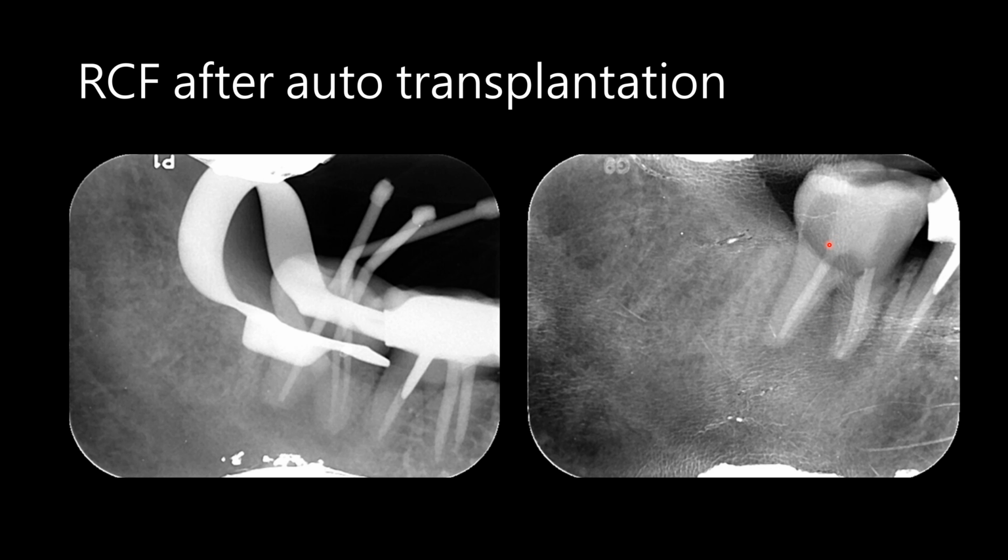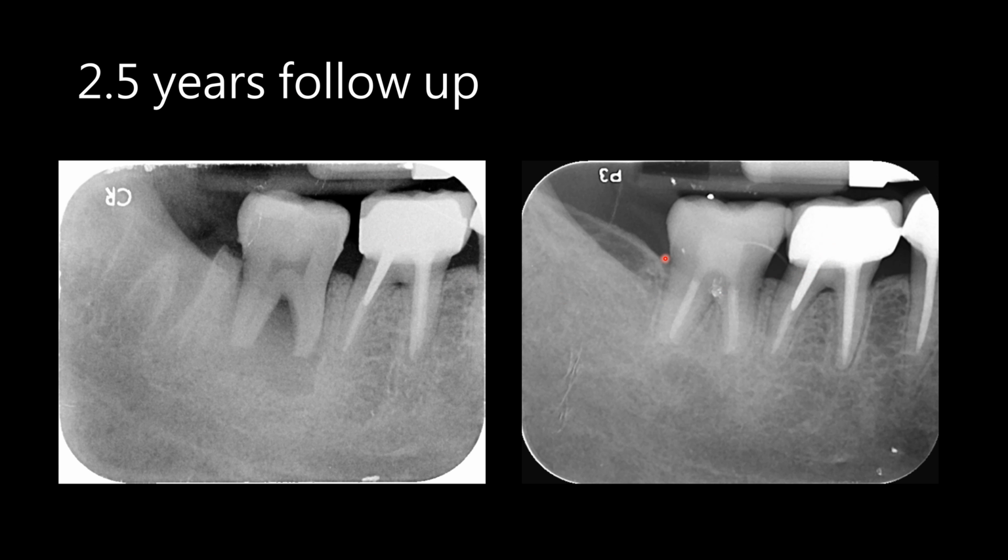So this is the pre-op, the digital planning, and the post-operative. And I finished the root canal treatment. So I have a 2.5 year follow-up, with endodontic treatment and an onlay on it.